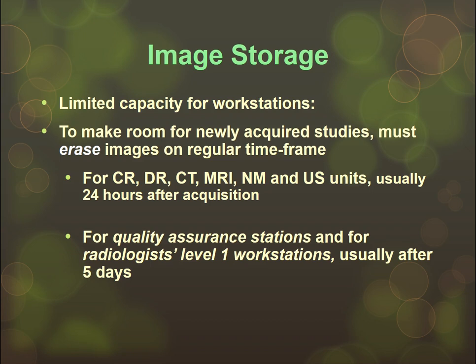For CR, DR, CT, MR, nuke med, and ultrasound, it's usually 24 hours after acquisition. So you do these studies all day long, they get stored locally, and then overnight they get erased to make more room on the hard drive so that you can have the next day's studies there for post-processing and review. For quality assurance stations and radiologists' workstations, they usually stay 5 days in the cache and then they get erased. Again, this is so that images can be manipulated quickly using the computing power of the PC.